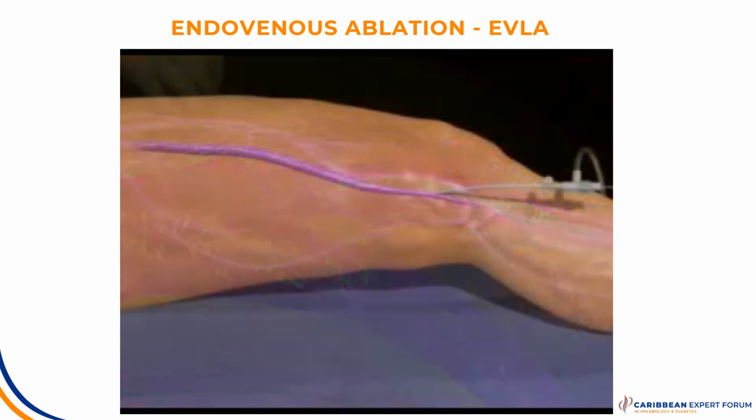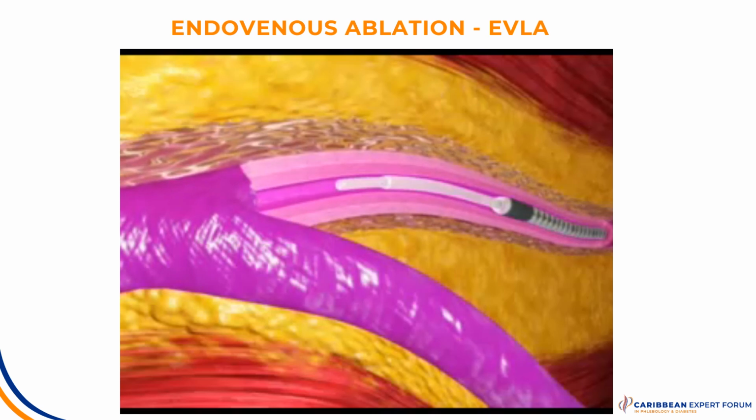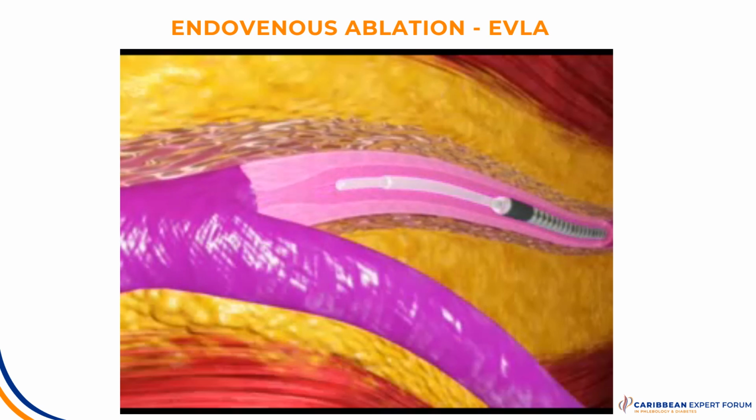More recently, using radial fibers, laser crossectomy is performed in which a radial laser fiber is placed 0.5 centimeters from the saphenofemoral junction. Studies have shown that there is a low rate of thermal damage to the deep veins, that is EHIT, and recurrence from the accessory GSV and ascending branches of the GSV is reduced.